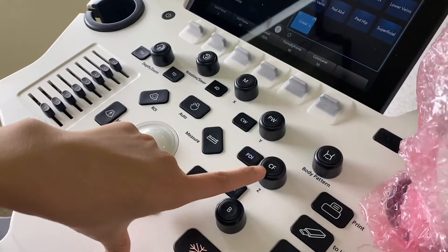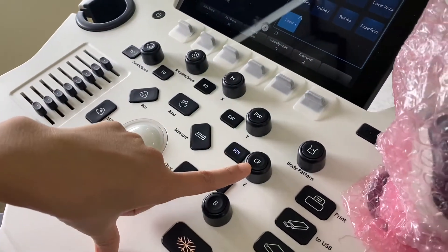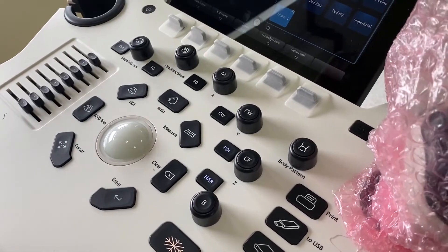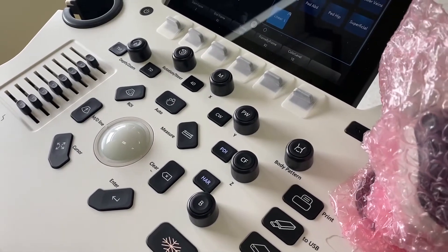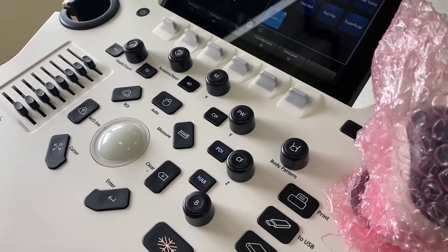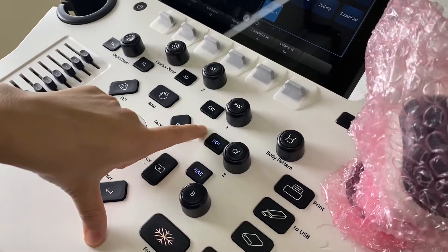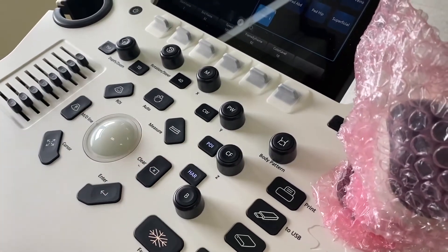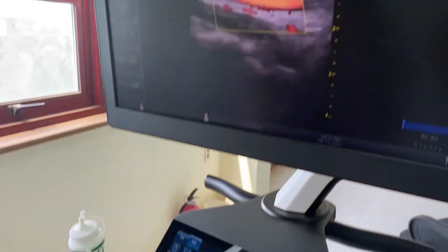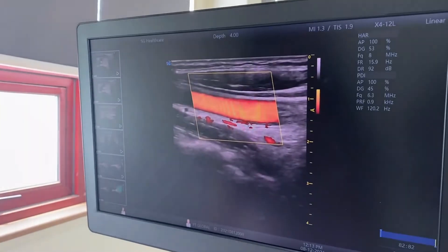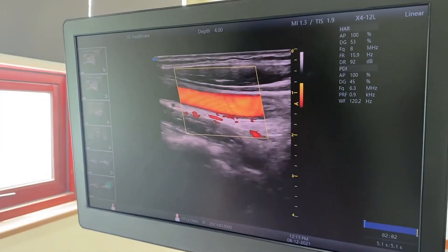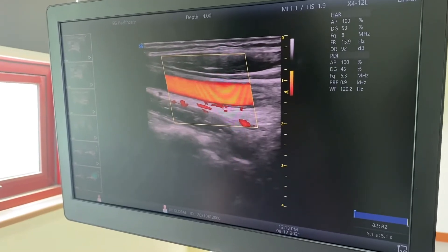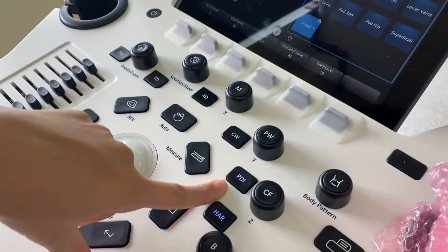Color Flow is used to confirm vascularity on great vessels like the aorta and IVC. PDI is used to assess vascularity within organs or tumors — for example in the liver, kidney, or gallbladder — to see the blood supply within that organ. We usually use PDI for that purpose.